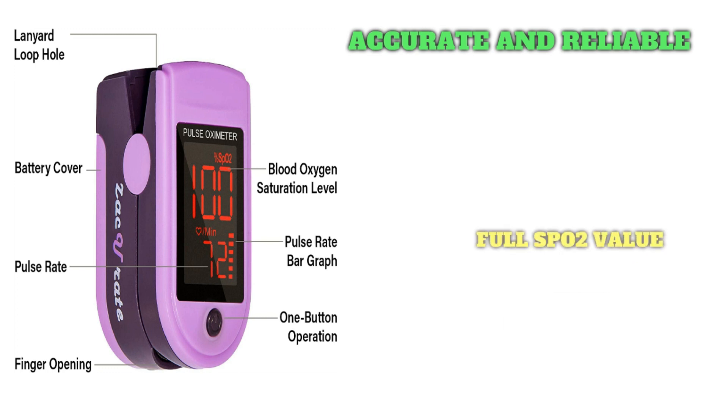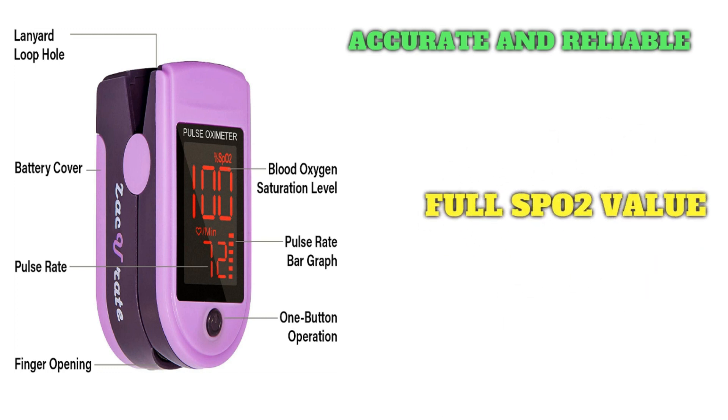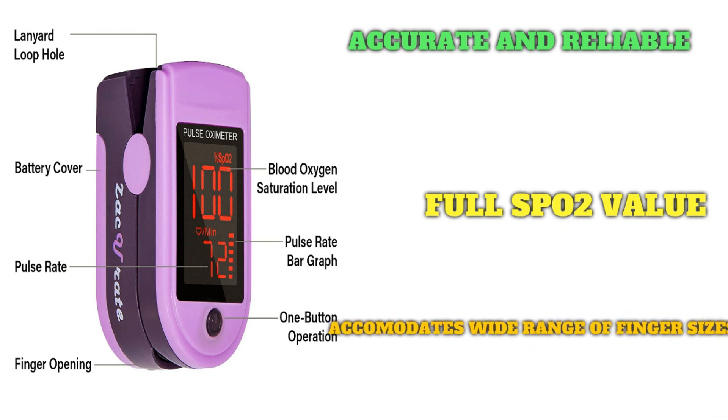The SpO2 and pulse rate display faces toward the user for easy reading, with a red dot finger chamber and smart spring system. Works for ages 12 and above. Includes 2 AAA batteries, a silicone cover to protect from dirt and physical damage, and a lanyard for convenience. Comes with a 12-month warranty and USA-based technical phone support.